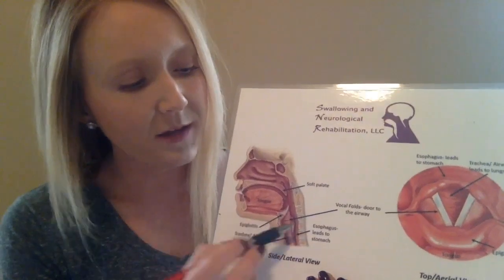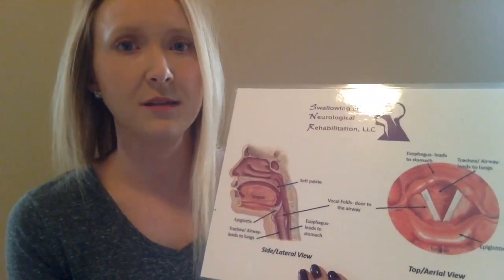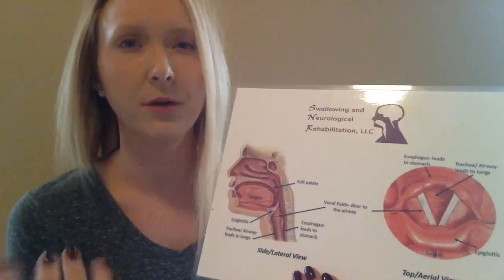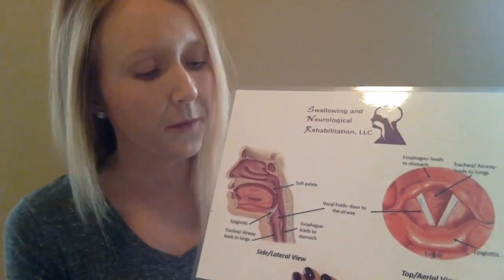The back tube is the esophagus. This is the one that does lead to our stomach. This is where the food, liquid, pill, or whatever we swallow should go — this is where we want it to go.